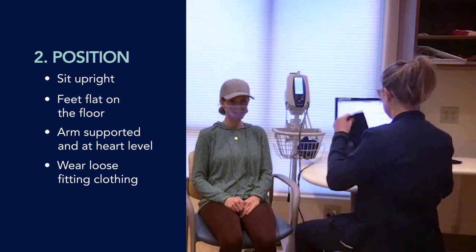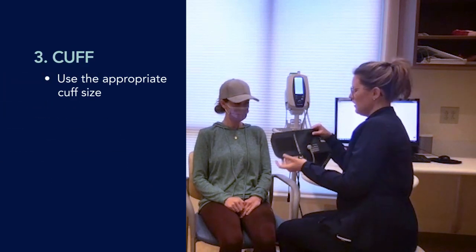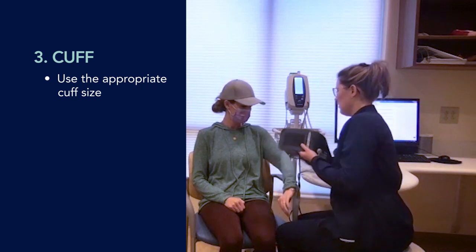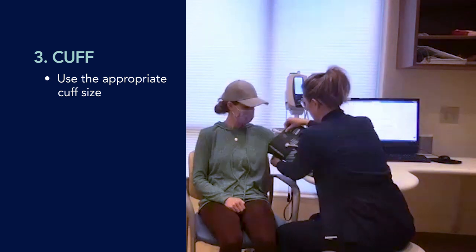Position is important — you want to sit upright. We also want to make sure that we're using the appropriate cuff size. For this patient's arm, it is smaller, so we're going to use a smaller cuff. This shirt is thin, so what she has on is appropriate and we can put the cuff over the top of her shirt.